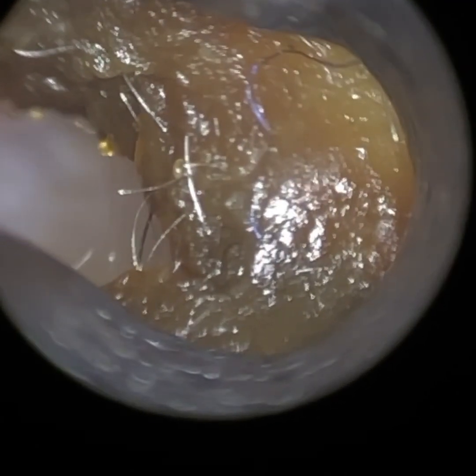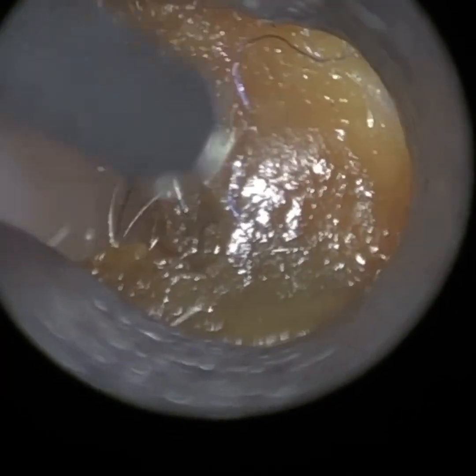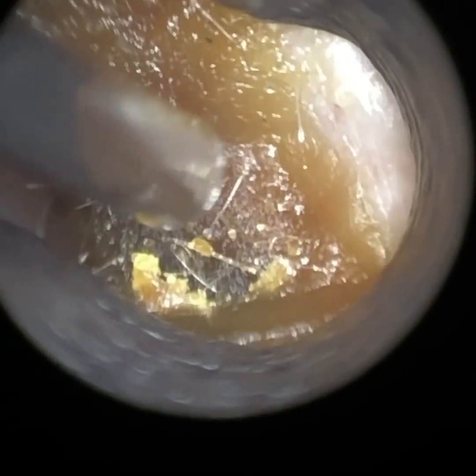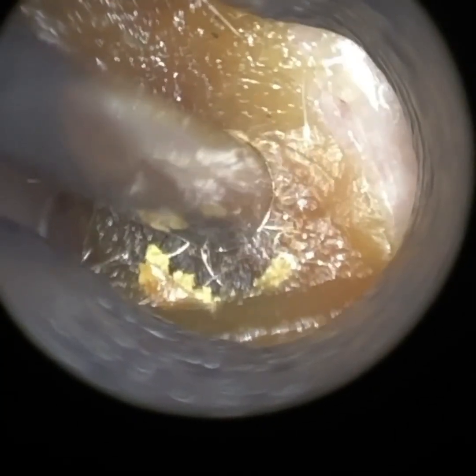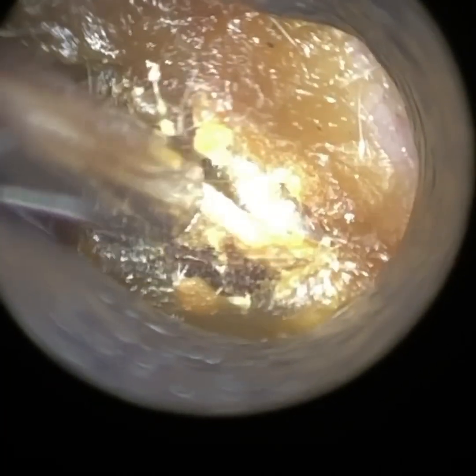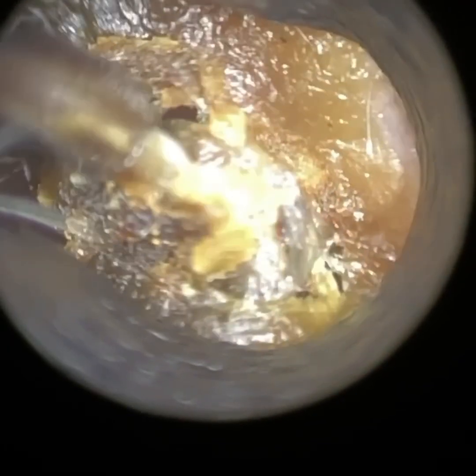This is a procedure performed on a client who is a hearing aid client of mine, who tends regularly to have their ears cleaned. Their ears are not fully occluded with wax — I would say semi-partially occluding, even in the right ear. This is the left ear, where there is more wax. The wax causes acoustic feedback with their hearing aids, and their wax traps and wax guards are continuously getting blocked. So the patient has quite sensitive ears.